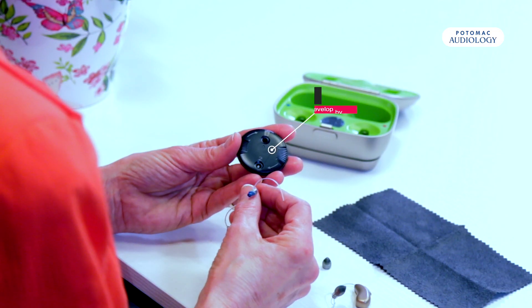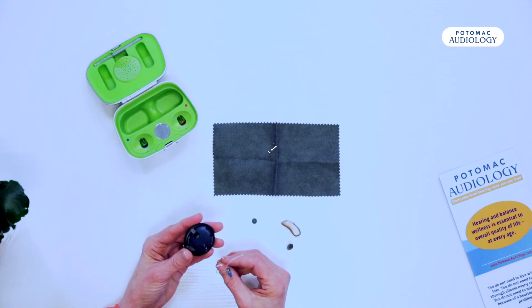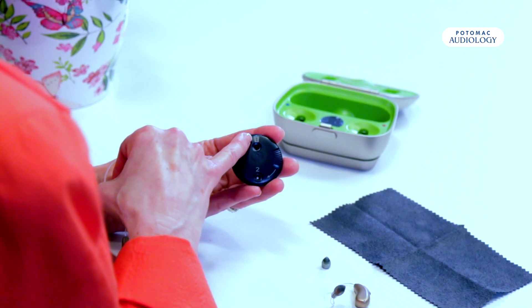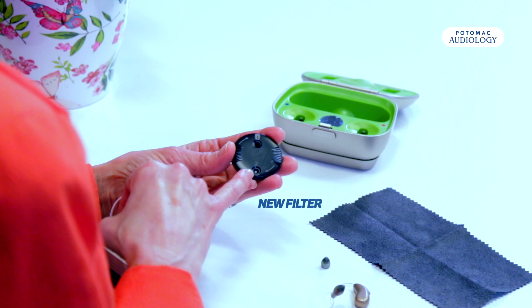We have some wax filters here that were developed by Phonak — it's a little disc that rotates. We have a trash can here at number one and we have a new filter at number two.